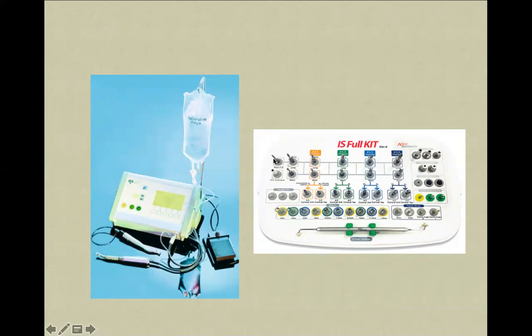You always should go from the left to the right, until the necessary diameter is obtained, because you are doing step-by-step widening of the drill hole. If you start with this, that will lead to overheating and mechanical stress to the bone, and that will interfere with the biological integration of the dental implant with the bone.